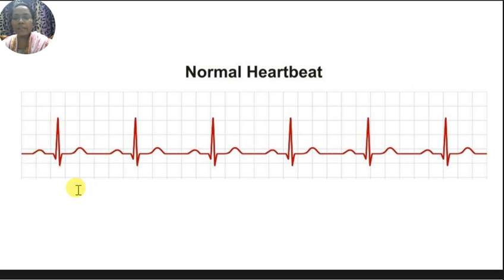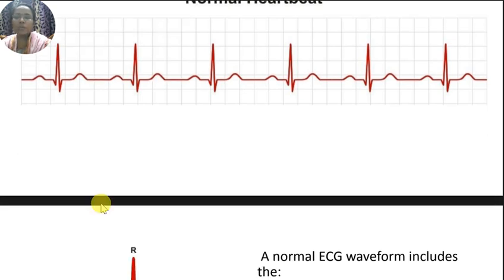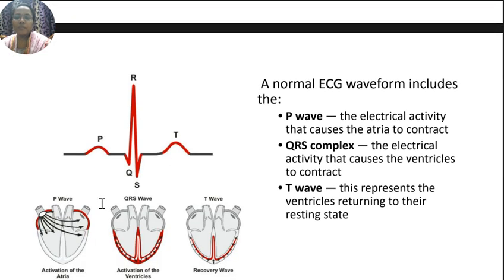The number of cardiac cycles is called the heart rate, or pulse rate. One complete cardiac cycle is represented by the PQRST waveform. Okay, what is the physiology behind this PQRST waveform? How does the P wave form, what does the QRS complex represent, and which activity of the heart does the ST segment represent? That is, what is the normal electrical activity of the heart? To pump the blood, contraction and relaxation are necessary, right? And for contraction and relaxation, an impulse is necessary, right?